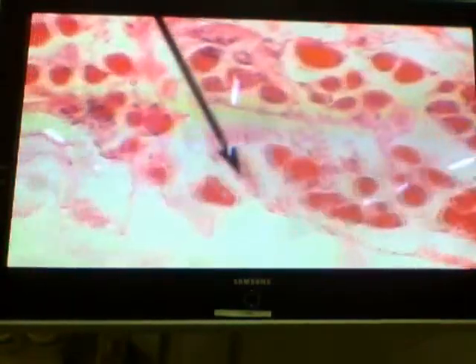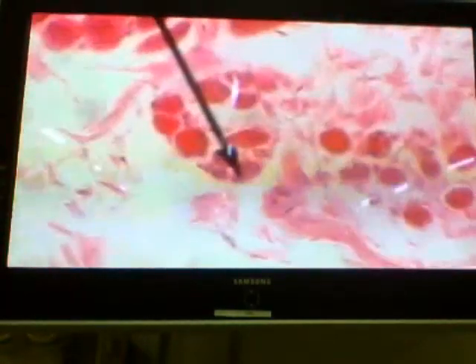Now underneath, deep to the lid, you'd also find some more smooth muscle. And muscles, let me get down on the low power. Right, so you see the skeletal muscle, and also you'll find other smooth muscle within. Some of that smooth muscle is going to belong to whom? Müller. So these fibers would be coming underneath LPS. These smooth muscle fibers underneath LPS are referred to as Müller's muscle.